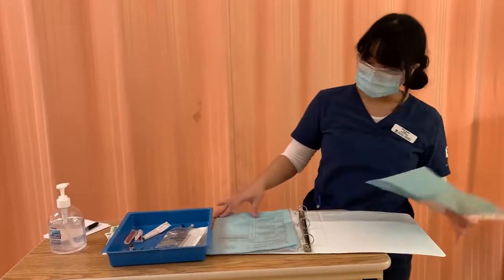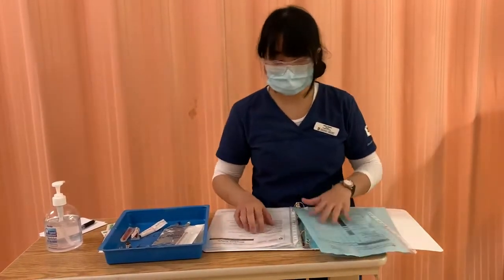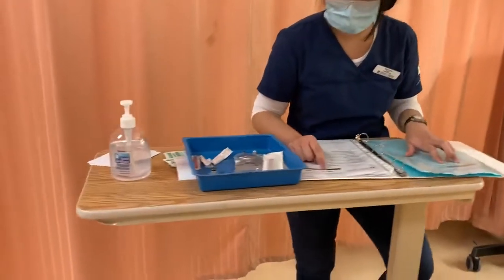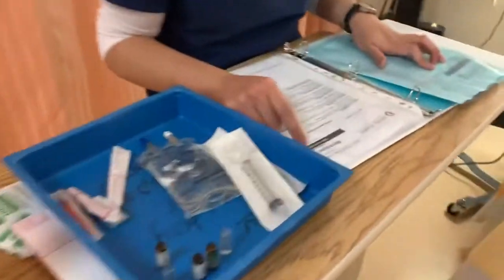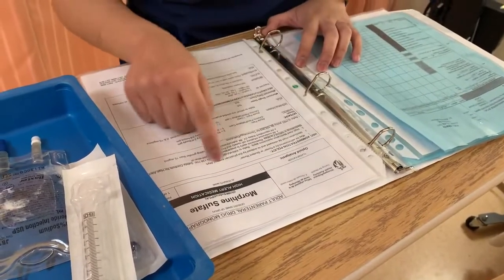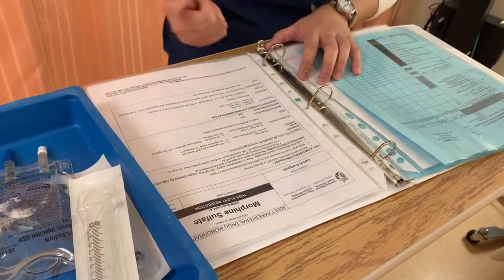So now I'm just gonna go take a look at our PDM. We got a medication, morphine sulfate, and morphine is right here. It's a high alert medication, so we know it's a 2-nurse check. And it can be given by PCA, and it can be given by a student nurse according to the policy as well. So I can give it. The medication must be reviewed and reordered by the physician every 7 days. We check that as well.